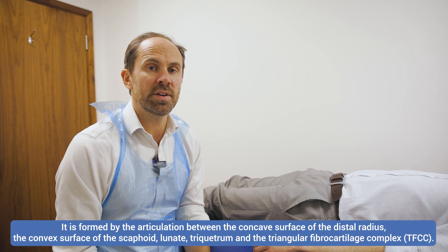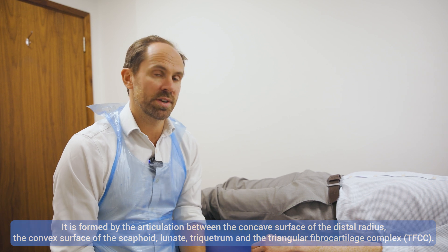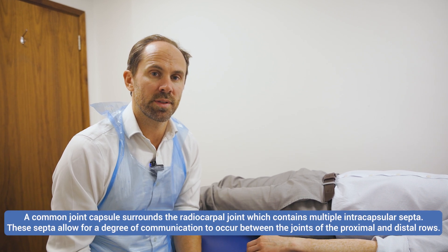Now we're going to show you how to carry out a wrist joint injection, or a radiocarpal joint injection. It's a very straightforward injection, and certainly if you're new to ultrasound-guided injections, it's one that you can get started with.